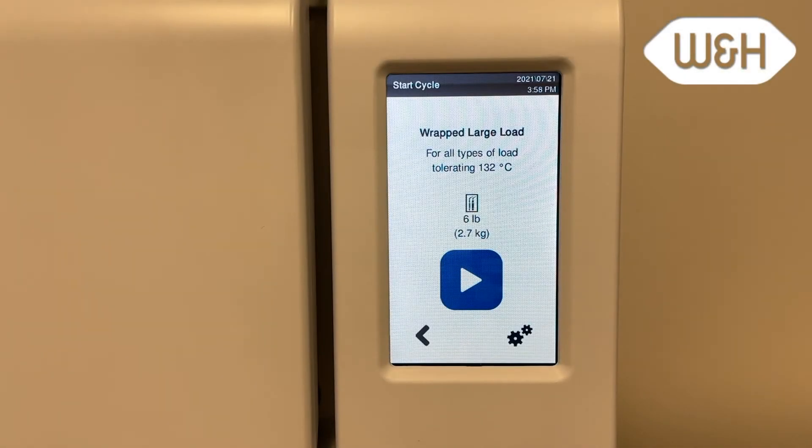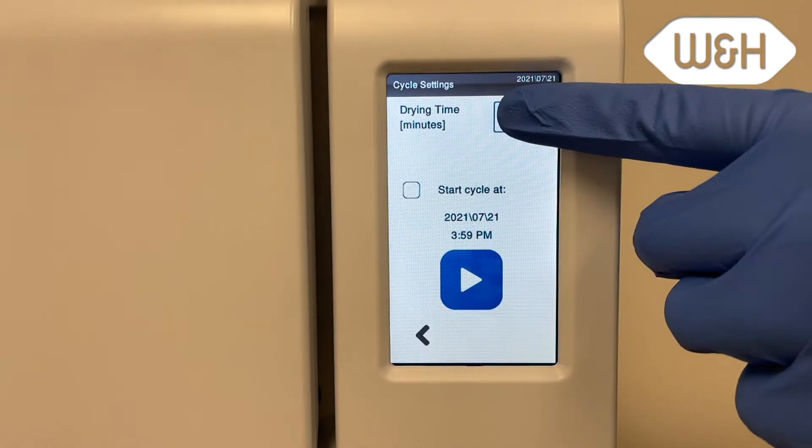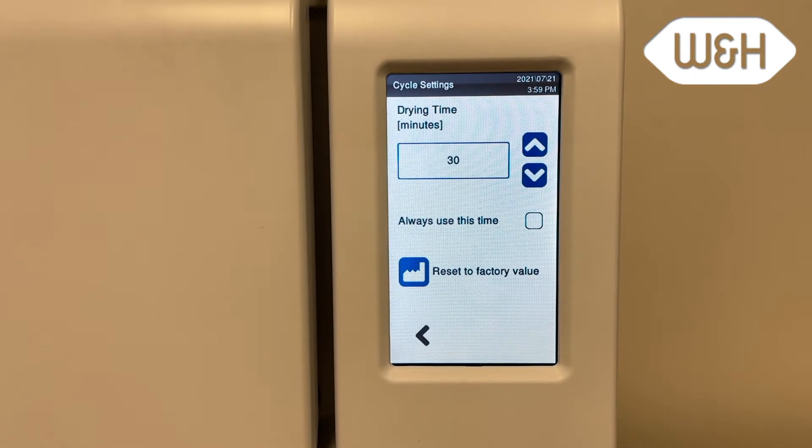When selecting a cycle, the user has the option to change the drying time. Before pressing the start button, press the settings button, then press the dry time. Use the arrows to change the dry time. You can check the box to make the new dry time a default for your cycle.